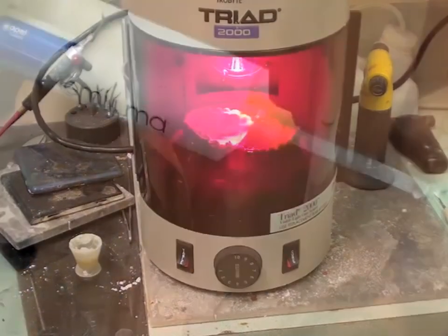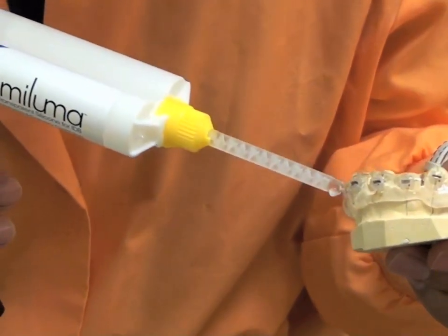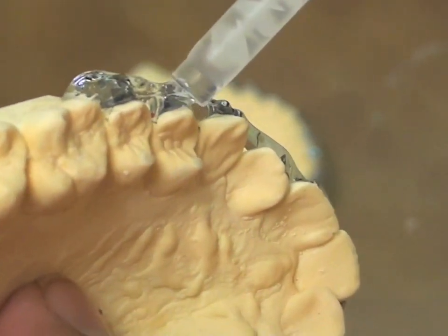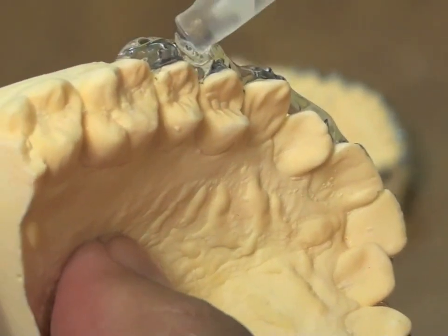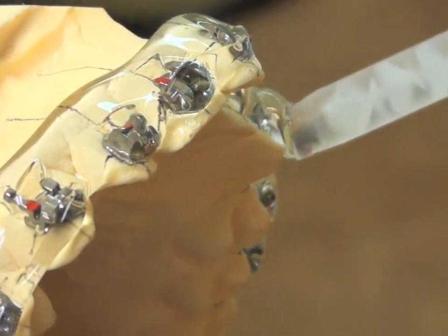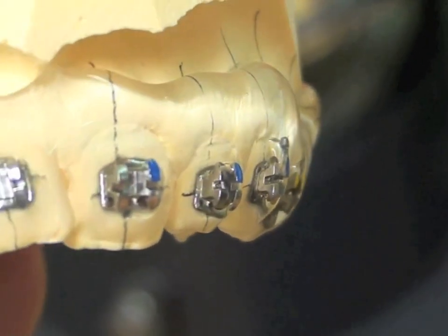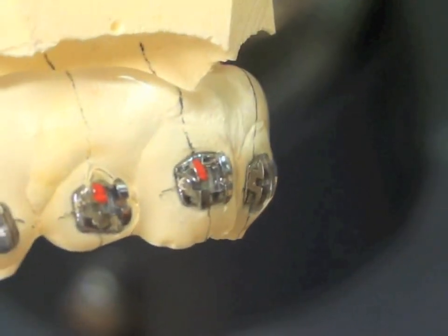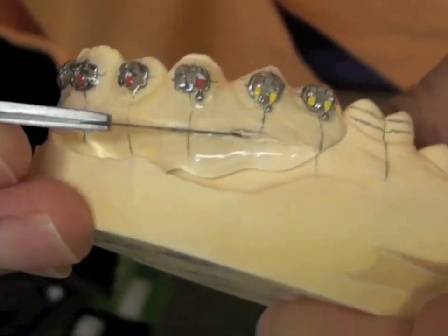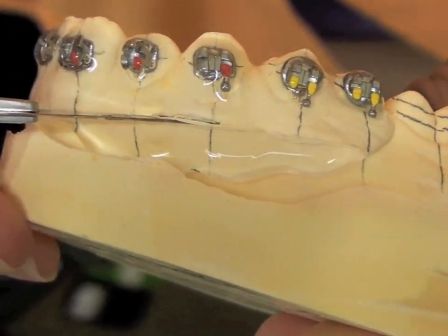We then follow a technique developed by Dr. Duncan Higgins. Emaluma is a clear PVS impression material that has very low tear strength for easy release and is ideal for the first layer of the custom tray. Slumping can be reduced by adding several layers in a back and forth motion. We encase all sides of the bracket to reduce flash. Excess material is then trimmed when hardened.